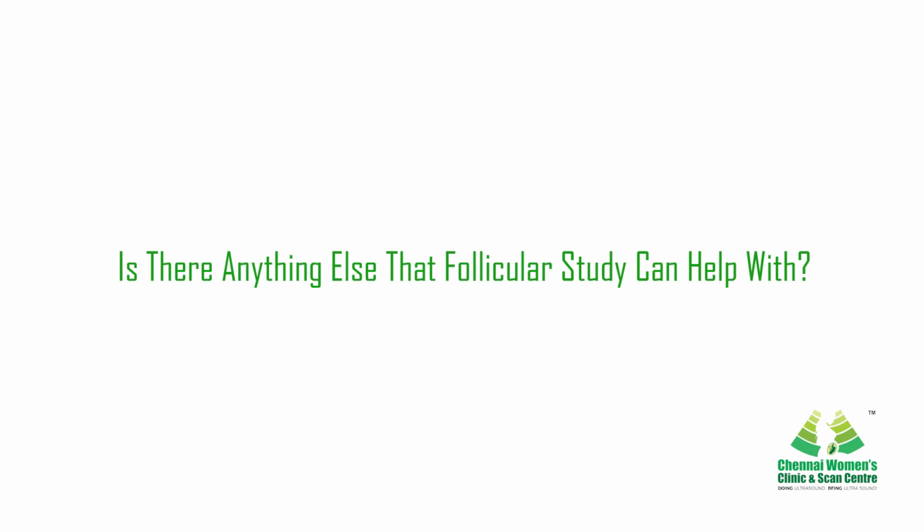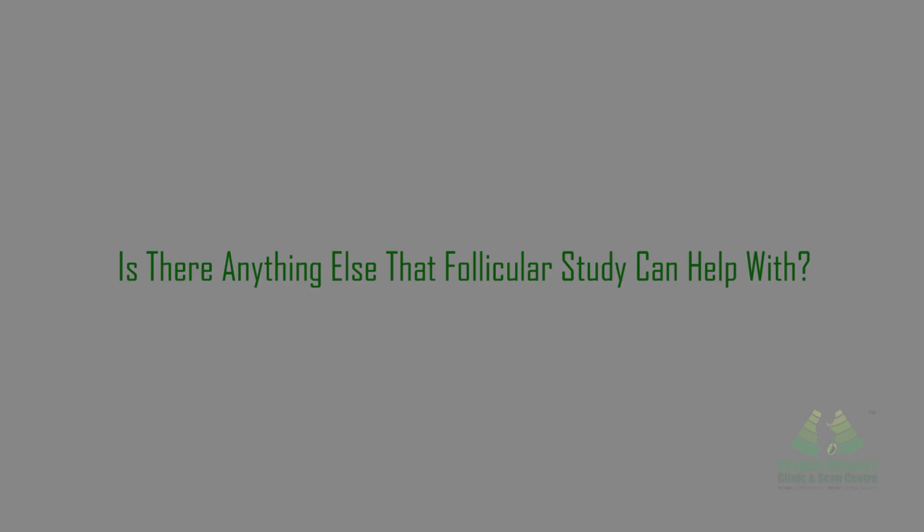Is there anything else that a follicular study can help with? Yes, as a fact, a follicular study will also detect some other issues that might impede a pregnancy. Some of them include: it will help to determine follicles that do not grow properly before rupturing, the thickening of the womb lining in conjunction with the follicular release, or follicles that do not grow at all or do not rupture at all during the menstrual cycle. All these parameters help the doctor to know what is happening and what is not happening. It makes it easier to identify the problems and thus impart treatment or corrective measures for the same.